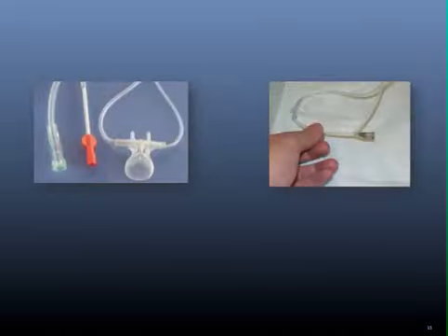There are commercially available nasal prongs that attach to most capnographs to put on these sedated patients, but if you don't have these, you can easily make your own by putting an angiocath and a nasal cannula. The trick here is not to attach the nasal cannula to oxygen because the wall supply will just totally wash out what's in the tube and you won't get a reading because it'll all be flowing the wrong direction.